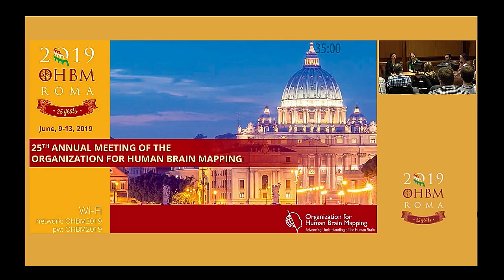And I just wanted to pick up on one point that Esther made, about how the artifacts would actually manifest as a result of the motion. That can really interact with how you've acquired the data. So, multiband versus standard 2D versus 3D EPI, which I was showing earlier. They can be really very different, and you have to see whether the metric that you're going to use to evaluate the data is going to pick that up, or whether it is maybe not sensitive to that.